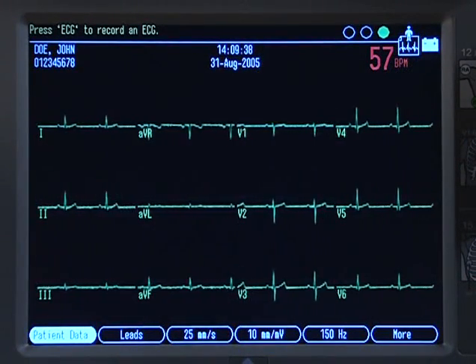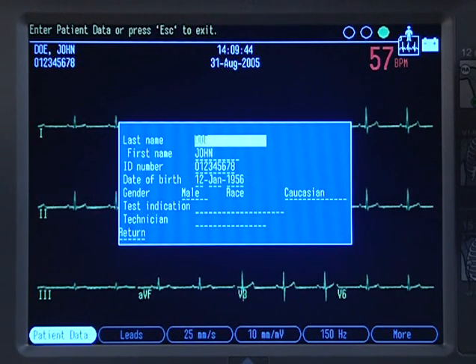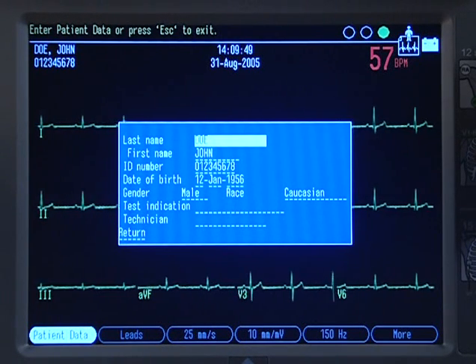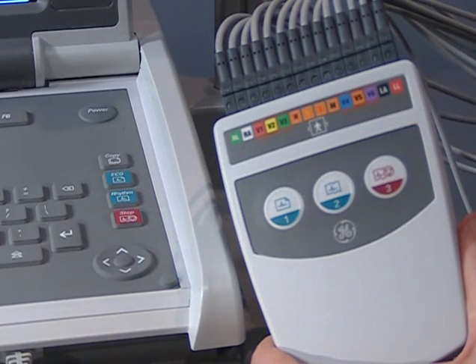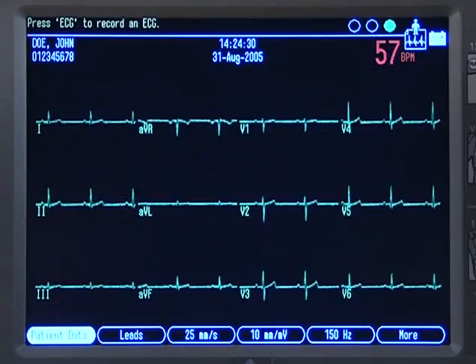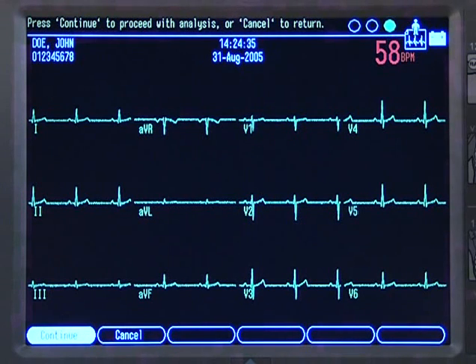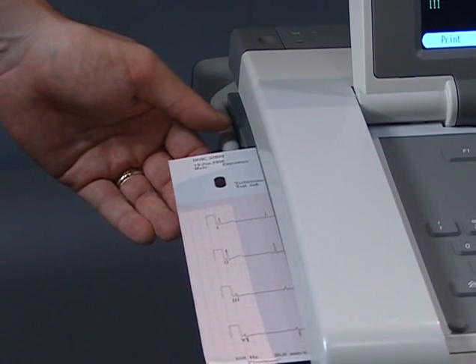The ECG screen flow and what you see on the patient data screen is guided by the choices you make in system setup. Your screen may be somewhat different than what you see here. Refer to your operator's manual or the clinical reference guide for further information about customization. To record the ECG, press the ECG key on the keypad or the first button on the acquisition module. When you press the ECG key, the screen will freeze, allowing you to preview the waveform before printing. At this point, you can press Continue or Cancel. Press Continue to print the report automatically and save the file.